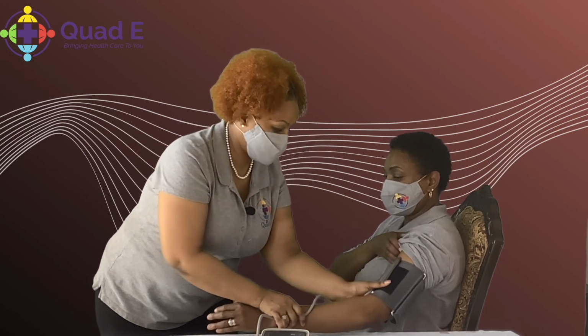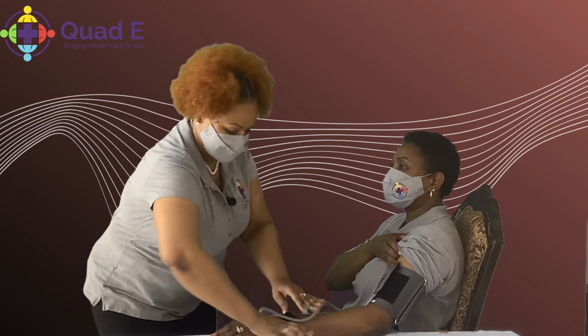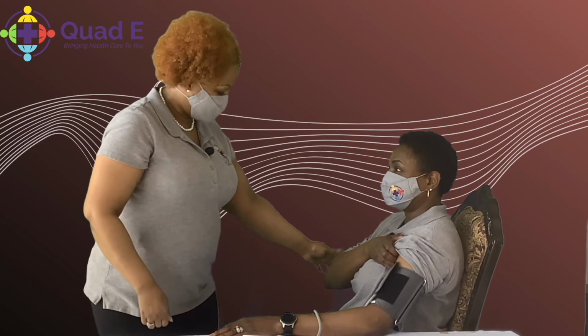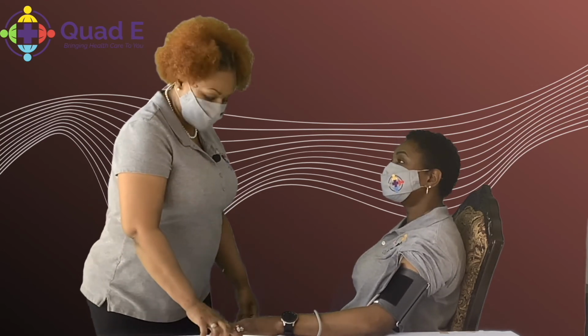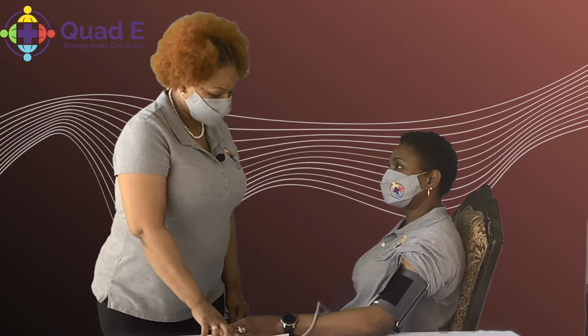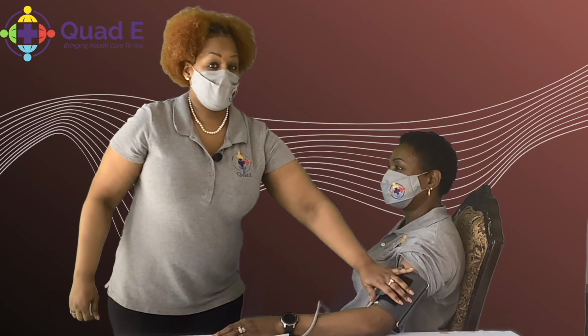And I'll let Miss Jeanette know, ma'am, you're going to feel it getting a little tight on you, like I'm giving you a really big hug on your arm, okay? And you can relax this arm right here, all right, and just breathe naturally. And so I went ahead and hit my start button, and it's starting to inflate, okay? And now we're just going to wait. I'll be waiting patiently, and she's going to be quiet, and she's going to be waiting as well. So no small talk, we're just waiting.